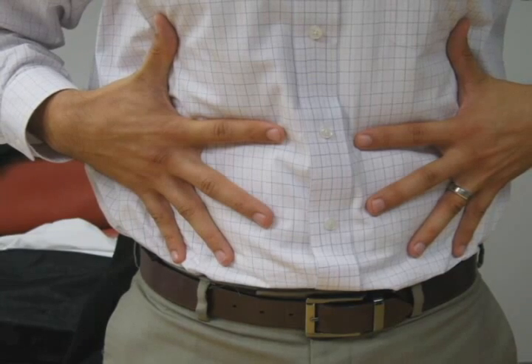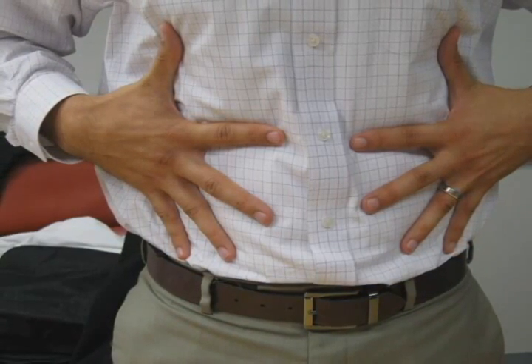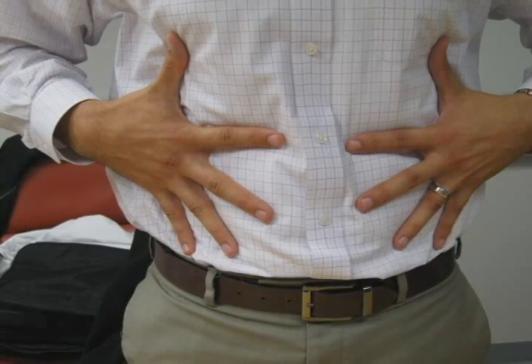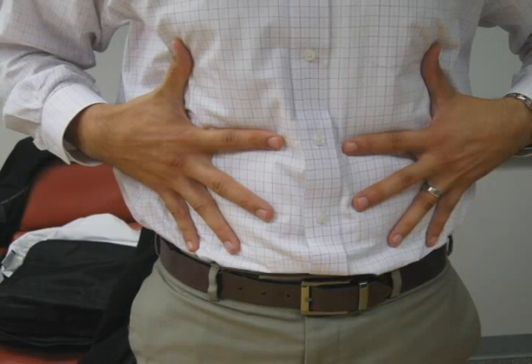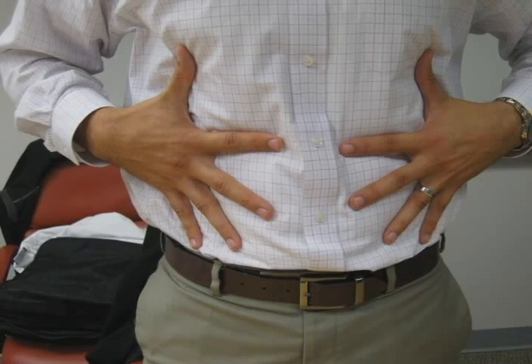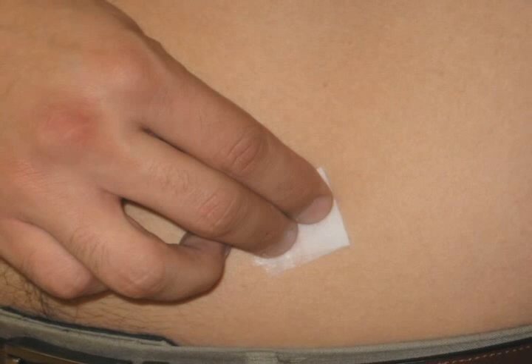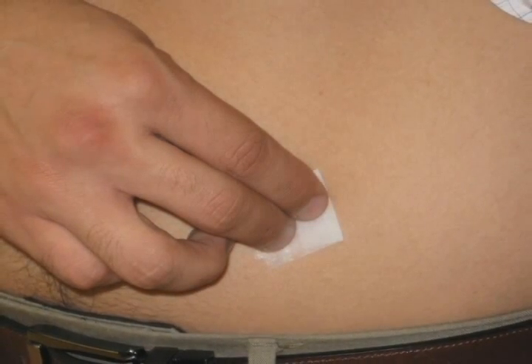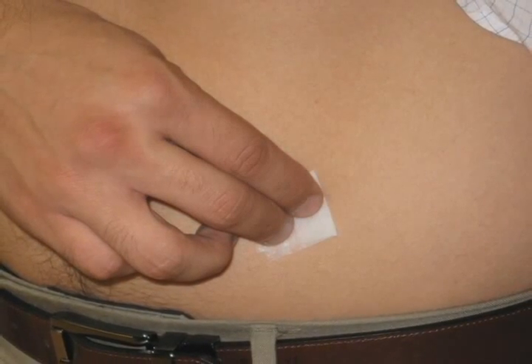When deciding where to inject your insulin, the optimal place is the abdominal region. In order to avoid the development of scar tissue, the 10-finger technique can be used to spread out the locations for each injection. Simply spread your hands across your stomach and rotate injection sites based on the location of the spaces between your 10 fingers. Before injecting the insulin, clean the area of injection with an alcohol wipe or with soap and water. It is important to allow this region to dry before injecting your insulin dose.